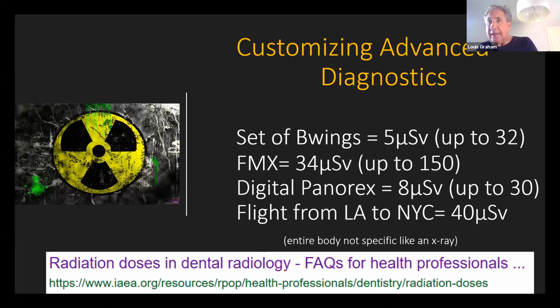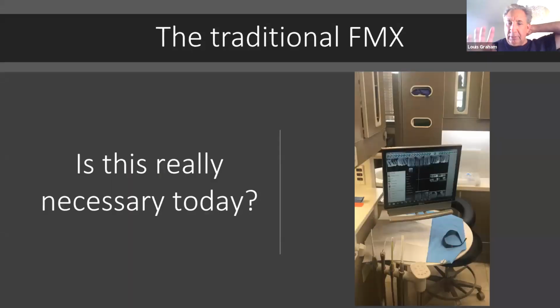And if you get on a plane, which none of us do anymore, and we fly from LA to New York, your body gets 40 microsieverts of radiation. So how does that relate? Okay, I'm just going to ask: is a full mouth series really necessary today? And it's really not.